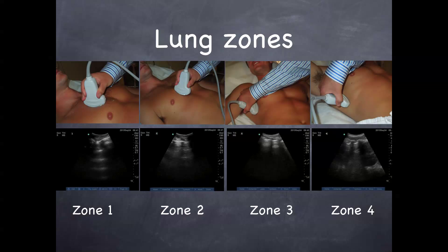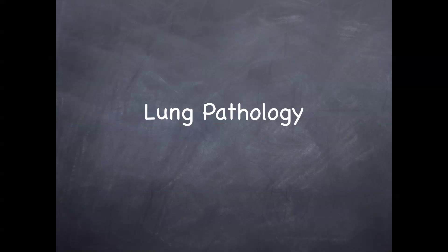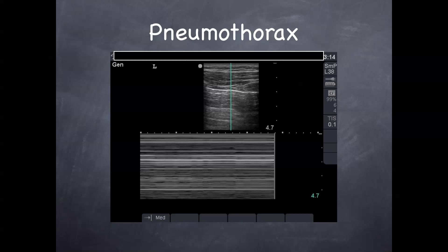Here are normal images of all four zones, and you can see where the probe is being held in each of these zones. Let's go over some abnormal — here are some pathologic images.